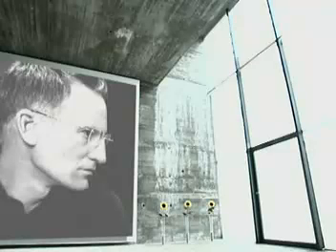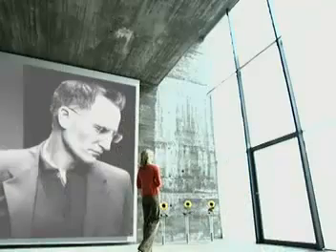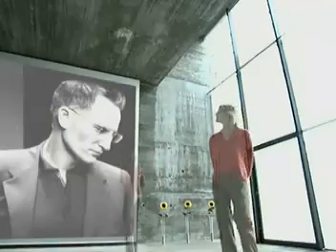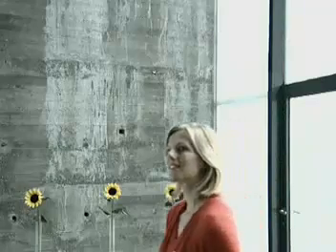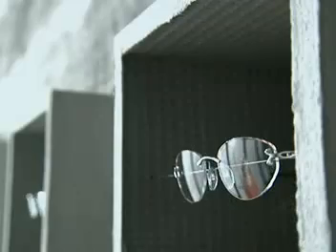Impression ILT progressive lenses. Simple measurement, individual fitting. Every person is different. Every face is different. The distance between the eyes, the shape of the nose, the position of the ears, all features which are unmistakable.